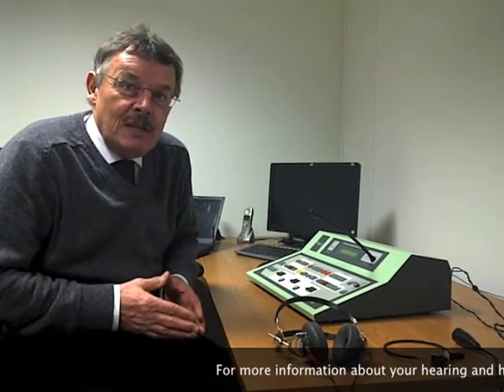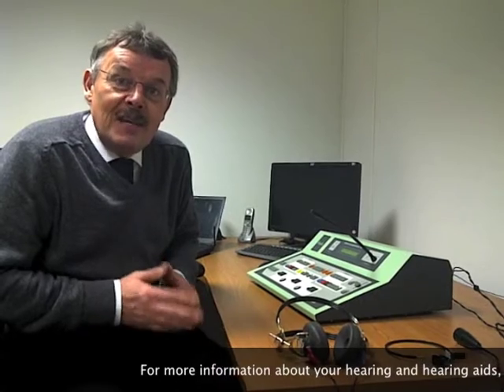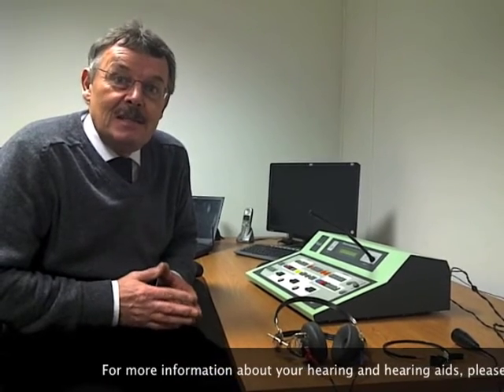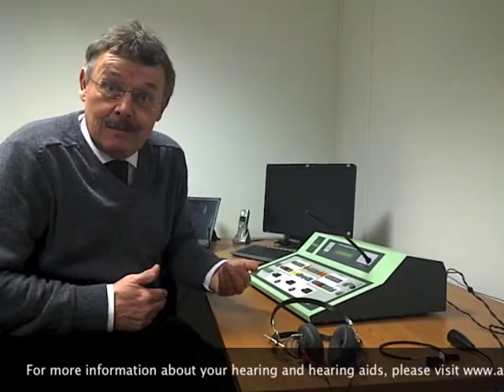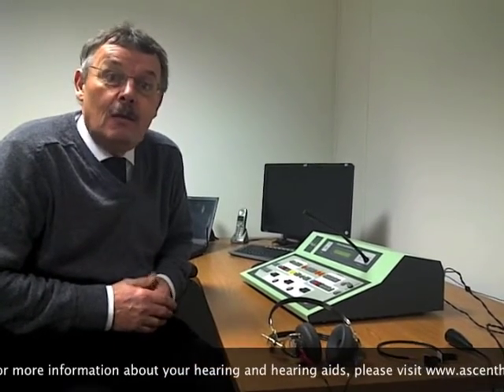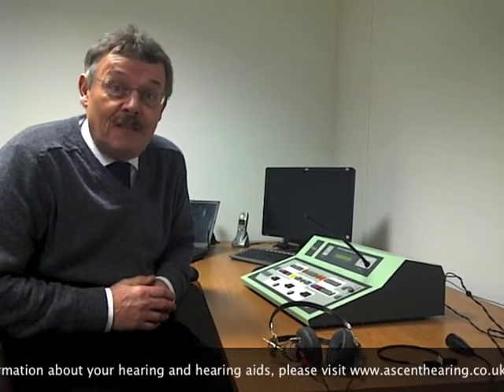And by the way, you can go on to www.ascenthearing.co.uk now and you can actually do a screening test yourself, so you'll get the idea of what I'm talking about. But basically, in a nutshell, a screening test is a pass-fail test. You're presented with a fixed intensity signal and you either hear it and you pass, you respond positively, or if you don't hear it and you don't respond on that particular tone, you fail.